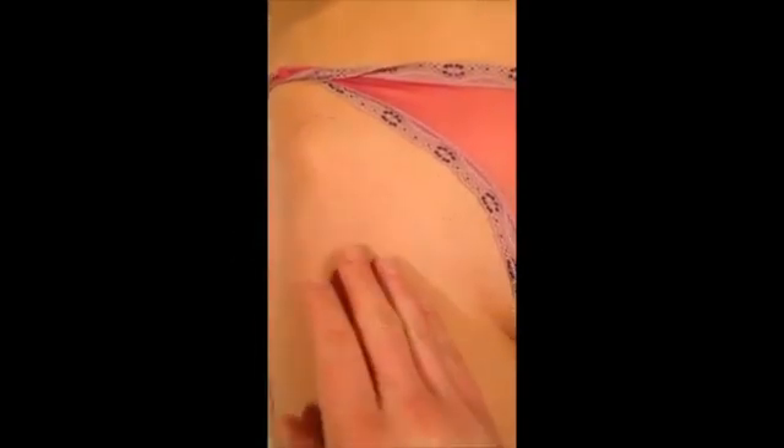First, in positioning the transducer, we're going to angle the probe from the ASIS to the pubic bone. That's going to be the angle the transducer is inserted on the patient. And normally it lies right in that fold when you bring your leg to the chest — it's that fold there. So we lay the transducer down.